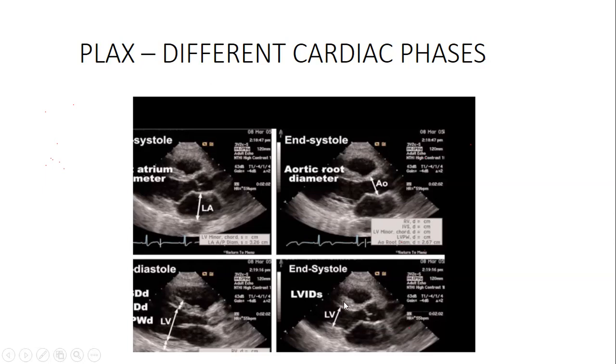It's thick here compared to when it's in diastole. It's very thick. So when you want to quantify the thickness of the myocardium, the IVS, the septum, don't do it in systole. That's a disaster. And by the way, echo deals with very small figures. So any wrong technique, any wrong measurement, it simply means you are giving a wrong diagnosis. We'll explain that.